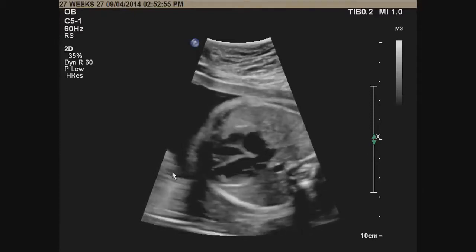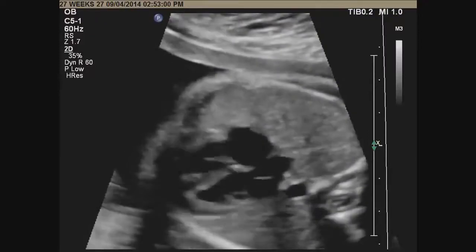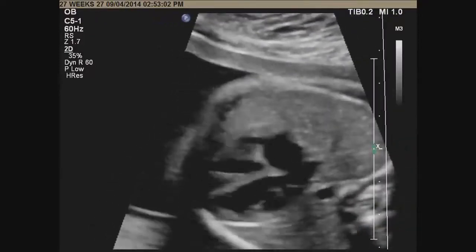Now before, maybe we can, why don't you magnify? Just going to go in. Yeah, okay, let's do that for now. Oops, sorry. Let me get the pointer back again.